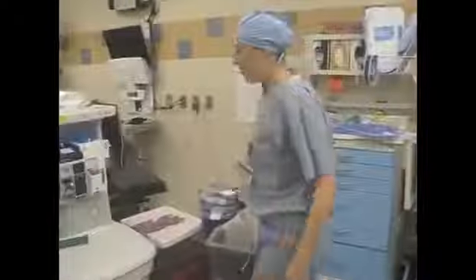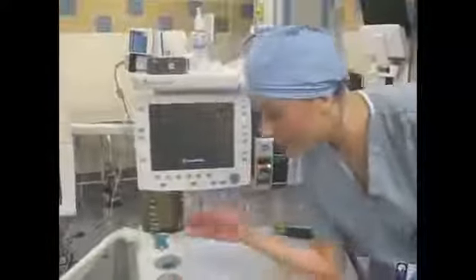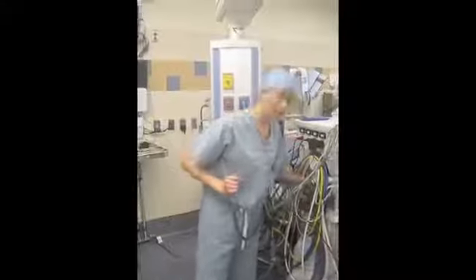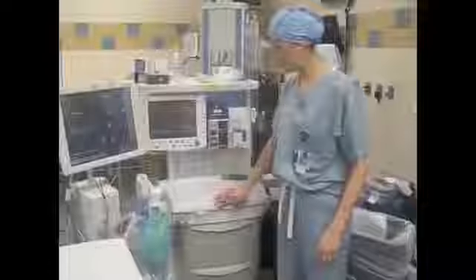I come in, the first thing I'm gonna do is turn on the anesthesia machine. While it's loading, check the suction for full power. If it's broken, it's turned off where you don't see. Take off pipeline, open the O2 tank, and be sure it's at least 1,000 PSI.